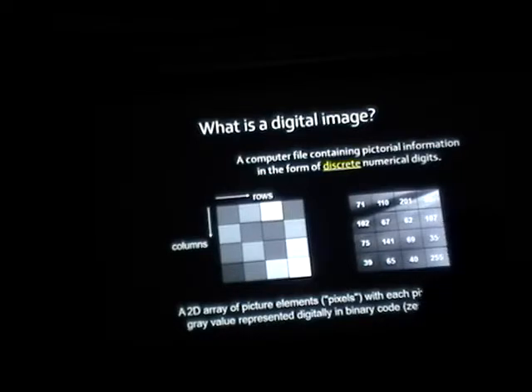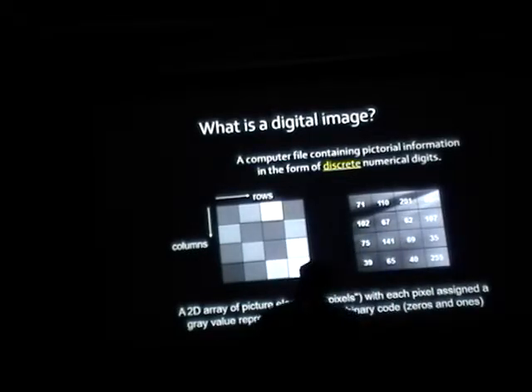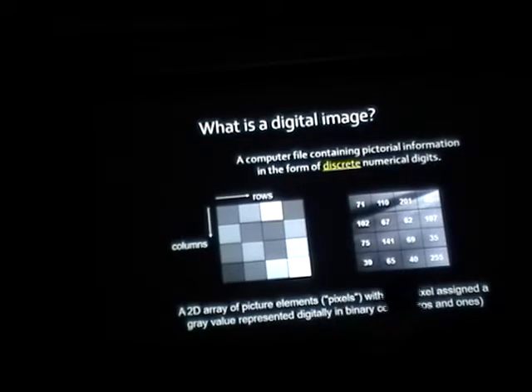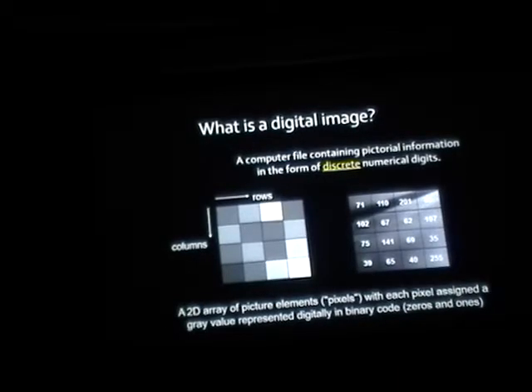Well, when we have to code this kind of stuff, the computer assigns different numbers, like in ASCII code. That's exactly right. So 39 means this is one grade, one level of gray. 65 means there's another number. By doing that, because the computer is spitting out those numbers, we are able to differentiate enamel, dentin, pulp, or if there is a restoration.